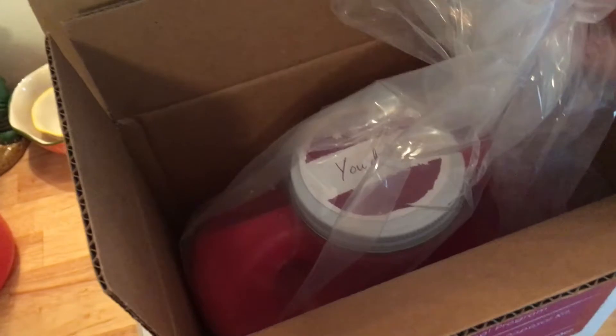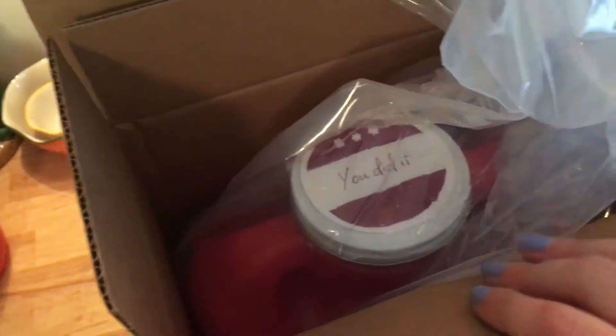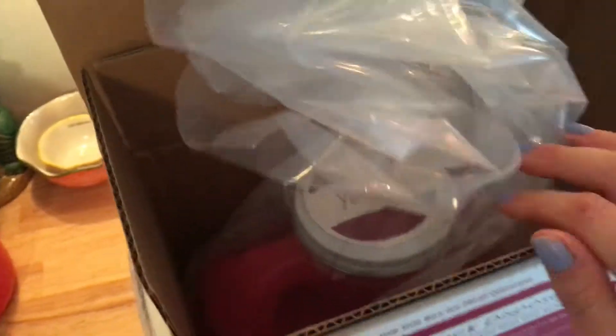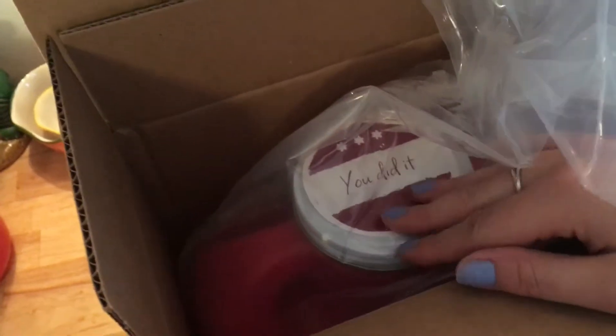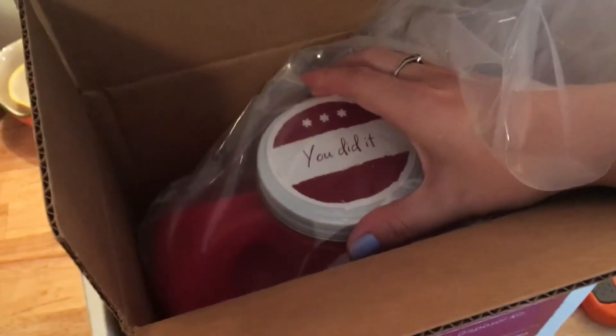This really thick bag is around the empty sharps container. Oh, it says 'You did it!' — I've never had that before. That's really nice, because you should be proud of yourself if you've been doing Humira this long and filled up your sharps box. It can be kind of scary for people, so it's nice knowing you've accomplished so many injections.